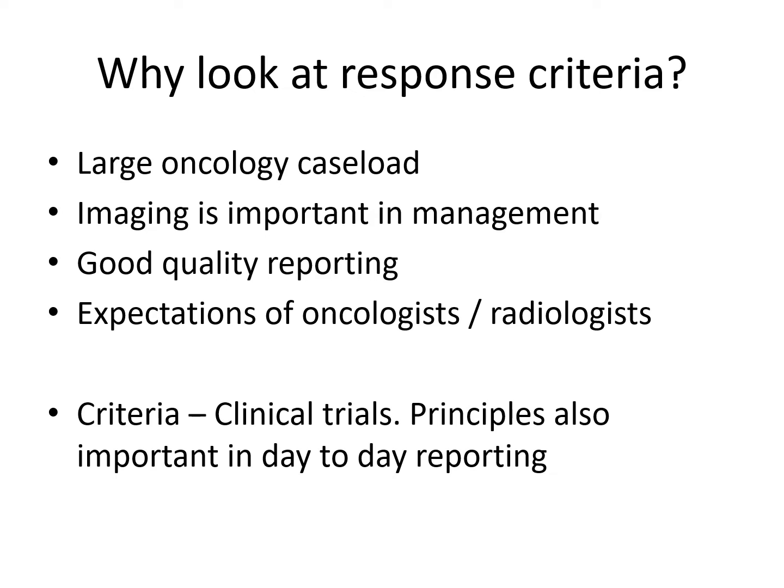Unfortunately, oftentimes we don't, and maybe we're rushing through, we don't do a good job, and we're not actually helping the oncologists, who may be more confused by the report than helped. So I want to talk about the actual response criteria, and these were obviously developed for clinical trials, but the principles and rules behind them can actually help us in our reporting and make it easier.